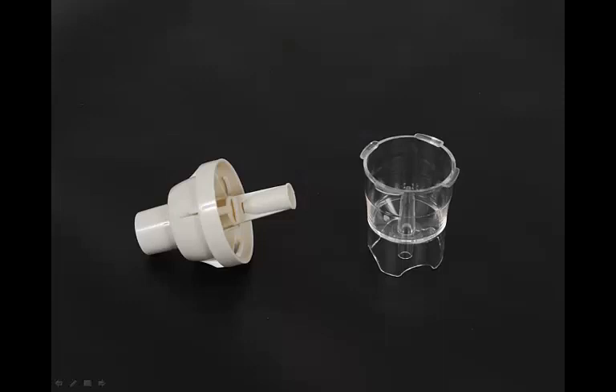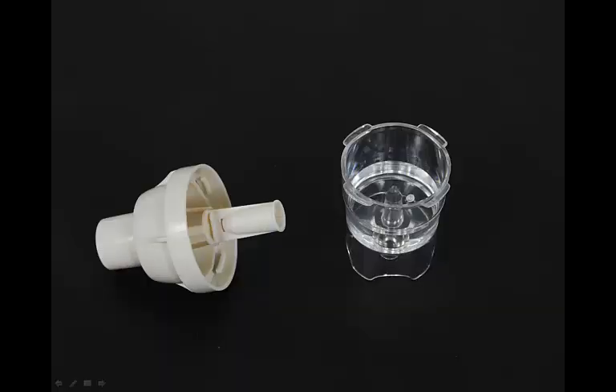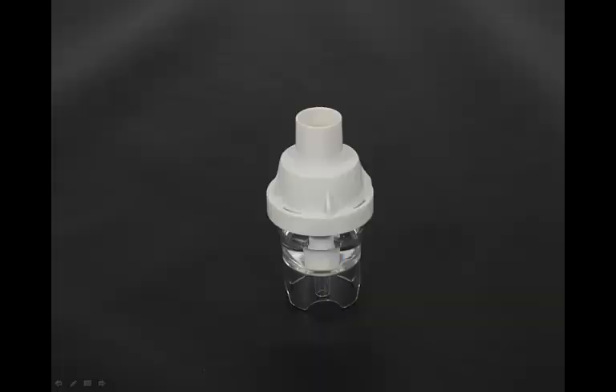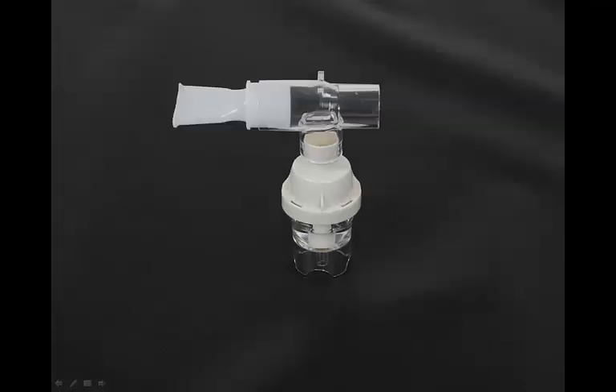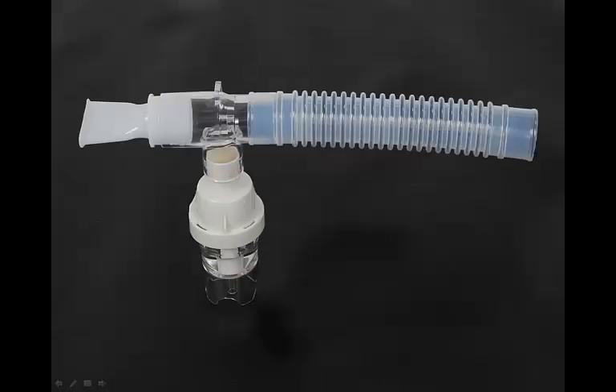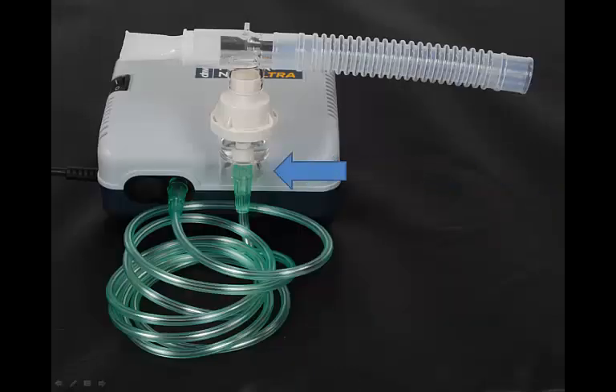Locate the nebulizer medicine cup and cap. Add the prescribed medication to the nebulizer cup, then affix the cap. Add the T-connector and mouthpiece as shown. Next, connect the reservoir tube. Connect the other end of the tubing to the air inlet connector found at the bottom of the nebulizer cup, then attach the nebulizer cup to the power nebulizer ultra as shown.